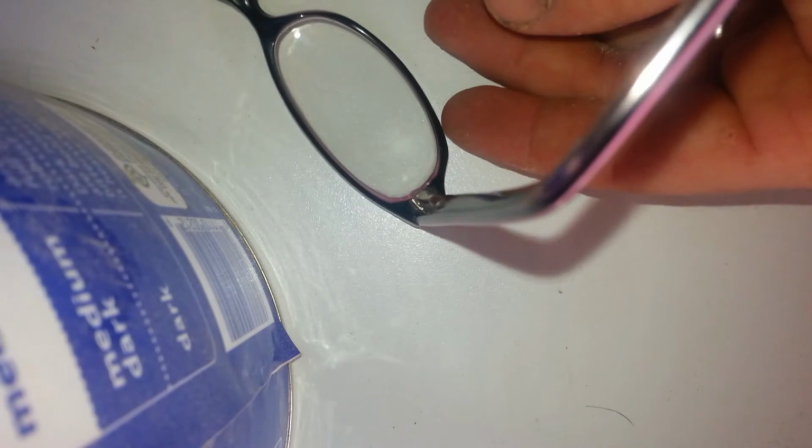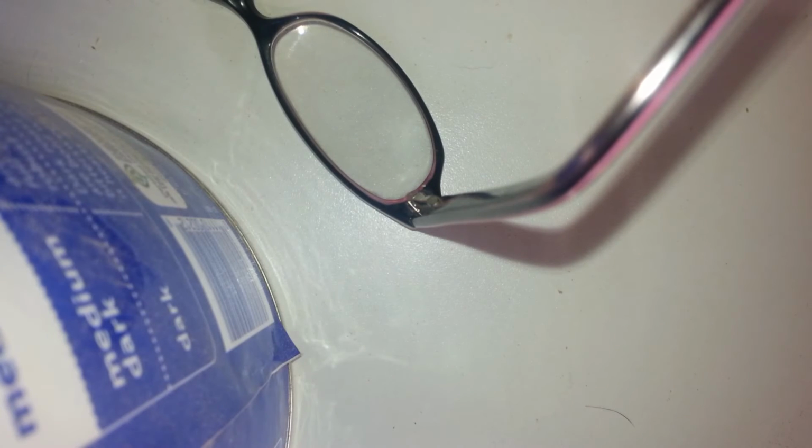You just let it cool off, and let the plastic melt right back into the metal, and the joint should be okay.